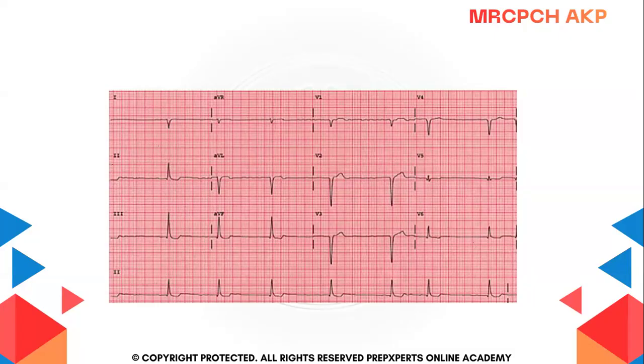But in case of right ventricular hypertrophy, we are going to get the right axis deviation, and in left ventricular hypertrophy, we are going to get the left axis deviation. Also in ostium primum, that is ASD of primum type or atrioventricular septal defect, we are going to get the left axis deviation, which we also call superior axis.